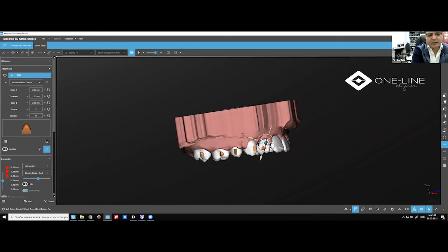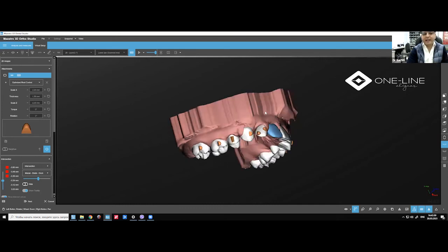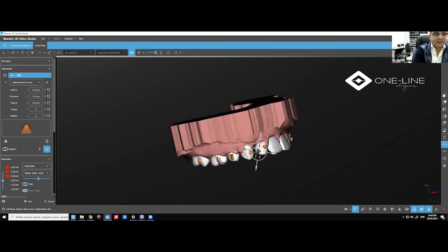So this is one of the places which you remember. You have to go as mesial, as incisal, as gingival, and as distal as possible. Same logic: you have to be at the corners. If you are in the middle, it will not work. But you can't get an extrusion with this kind of placement. This is only for tipping. Now, if you want tipping and a little bit of extrusion, yes.